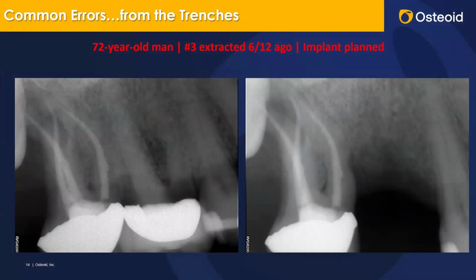But endodontics was involved because there are two conditions associated with the root canal filled tooth. The first one is probably the easiest to see, and that is that associated with the impacted third molar, there is a relative radiolucency associated with the apices of all of the three confluent apices of the mesiobuccal, distobuccal, and palatal root. And before implant was placed, we wanted to look at the prognosis of this particular tooth.